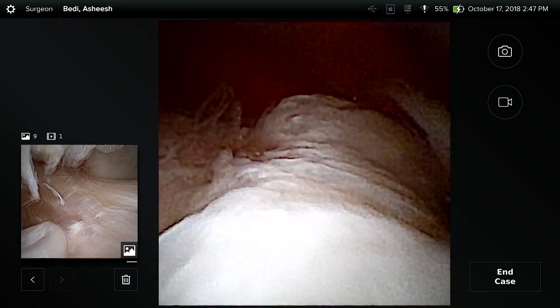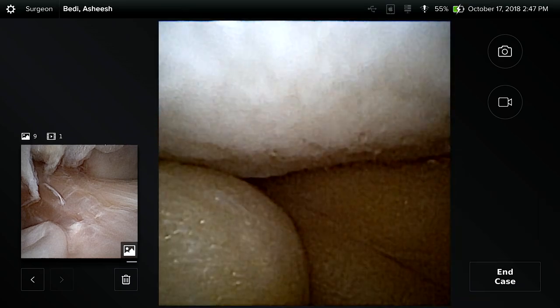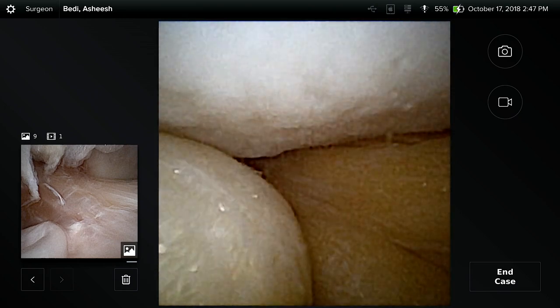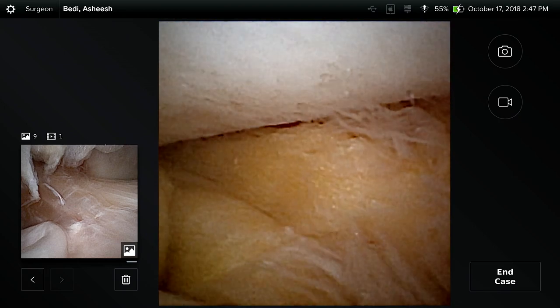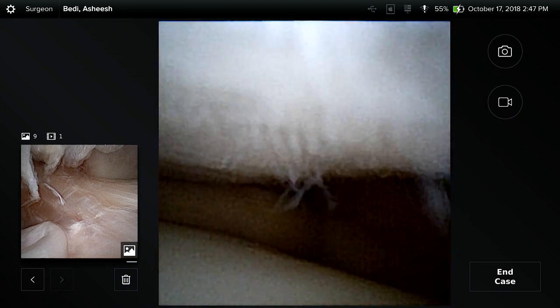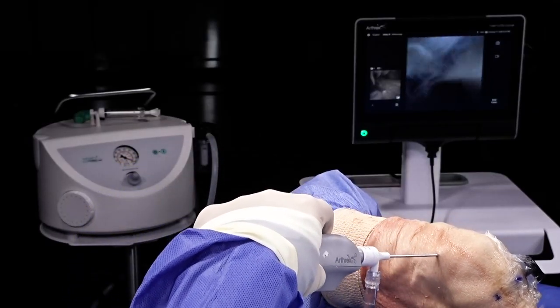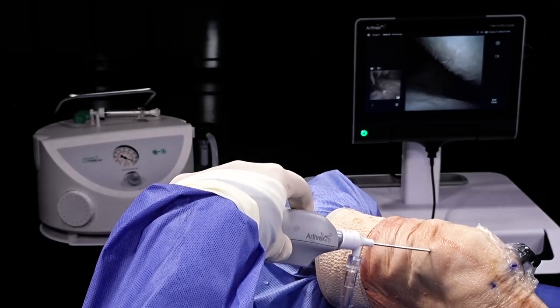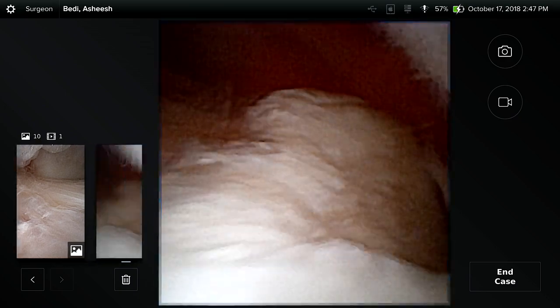Even with this zero degree scope we're able to get to every aspect of the joint in this minimally invasive way. You can see both our medial patellar facet and our lateral facet — I'm able to drive in and even show you the odd facet. Here's our deepest aspect of the trochlear groove, and we've done nothing to manipulate or injure the fat pad, which can be a source of bleeding, trauma, and pain.